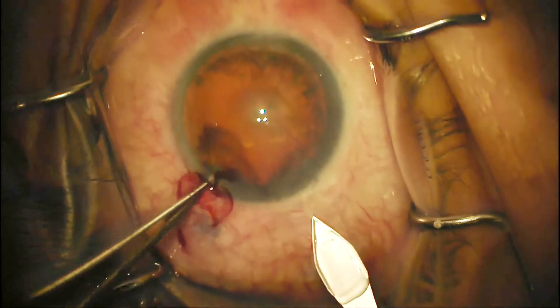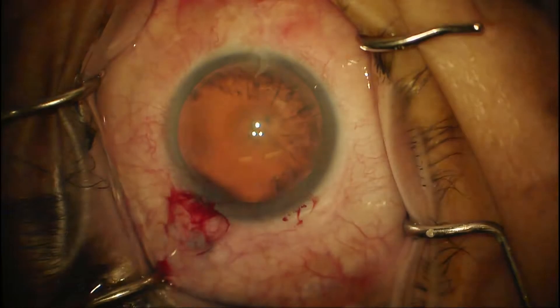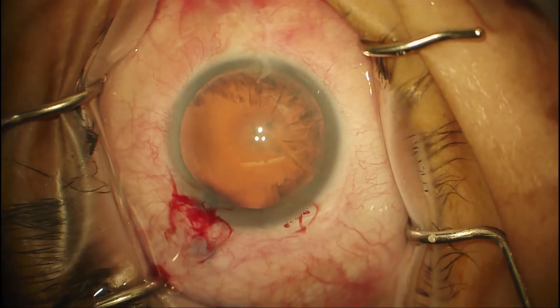If an incision is too short, you're going to get iris prolapse, and if it's too long, you're going to have distortion of the wound and poor visualization of the rest of the case.